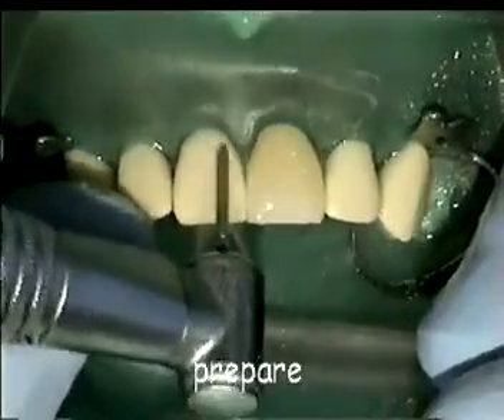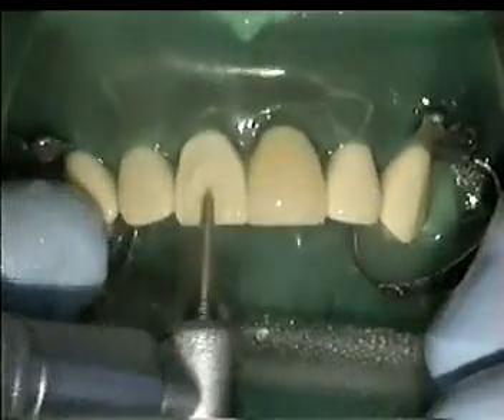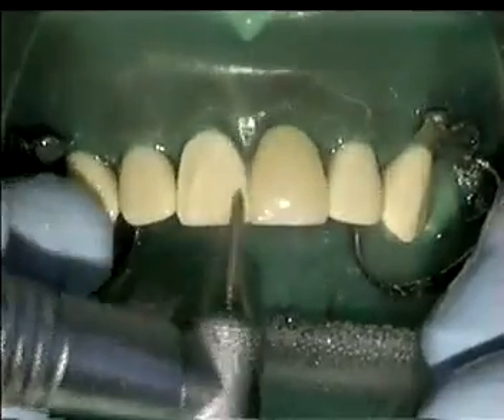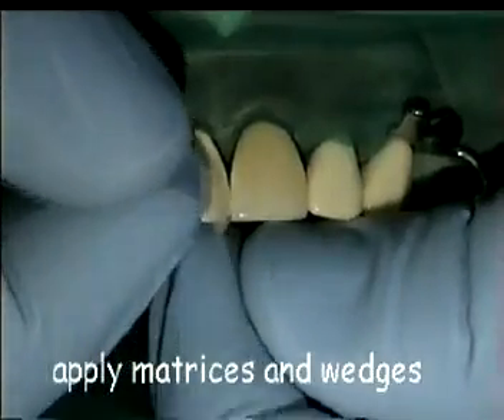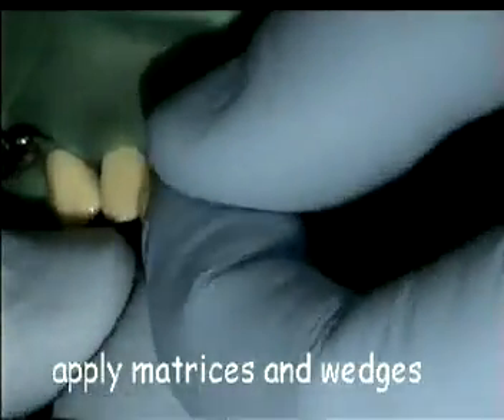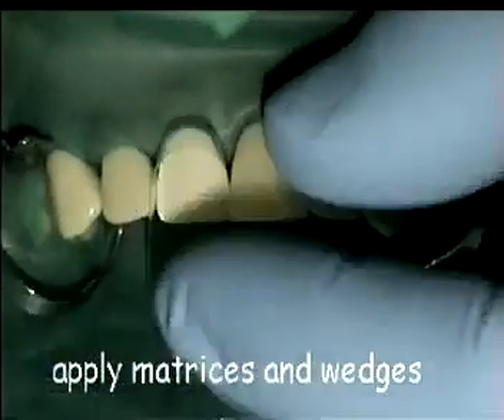If a preparation is needed, try to keep the outline out of the visual sight. There are a number of different matrix systems in use. In this case we show a cervical matrix held in place with interdental wedges.